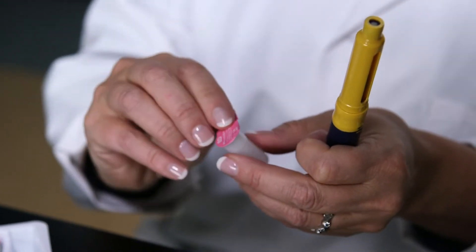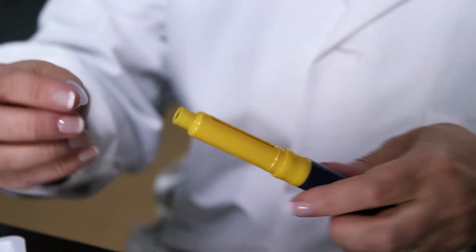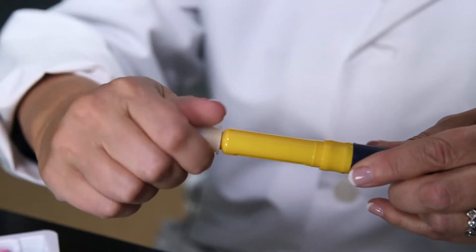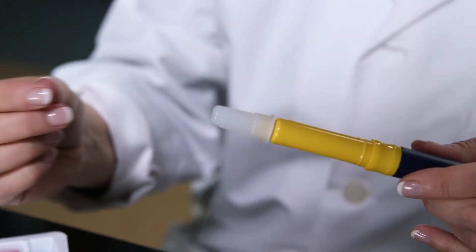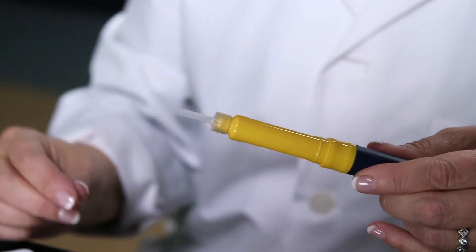Take out your pen needle, peel off the paper, place the pen needle onto the pen and screw into place. You don't need to over screw it. Pull off the outer needle cap and save that for later.